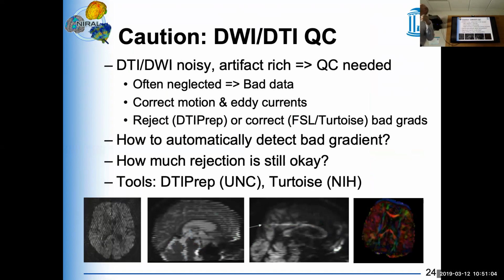It's version 5.13. There's a version 6.0, which actually does not yet have this. They say they'll update that in 6.1, so whenever 6.1 comes out, use that. The main thing here is that you have to have a way to detect errors and artifacts, and then either correct or reject them. Currently in our lab, we're more on the rejection side. Other labs are more on the correction side. We can debate which one is better, and that also depends on the application.